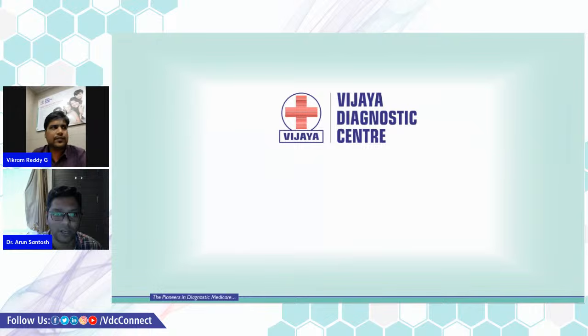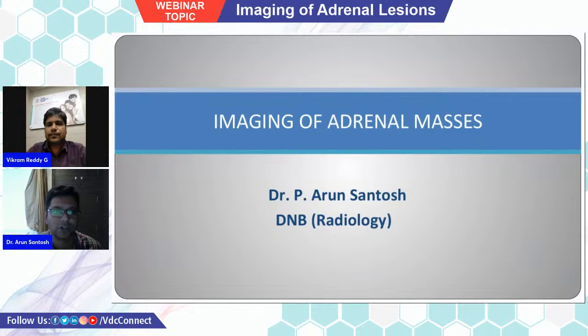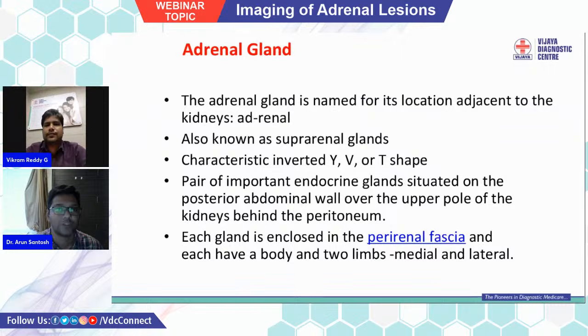Good afternoon, one and all. I thank Vijaya Diagnostic for giving me this opportunity. Today I'm going to present a short seminar on imaging of adrenal masses. So firstly, the adrenal gland.